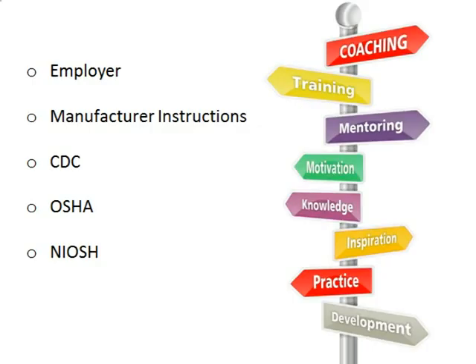In addition to this training, there are many resources available to answer your questions about respirators. First, seek answers from your supervisor or employer. Make sure you understand what is expected of you in terms of how and when to use the respirator. Assure that the respirator you are using is a right fit, using a fit test. Follow manufacturer instructions either from an insert with the package or by viewing a video.